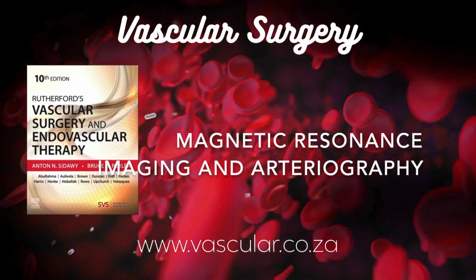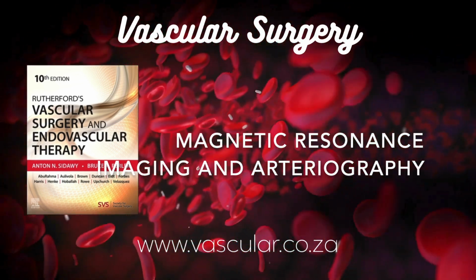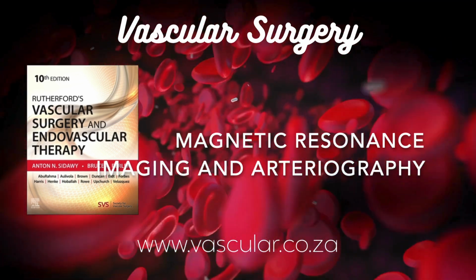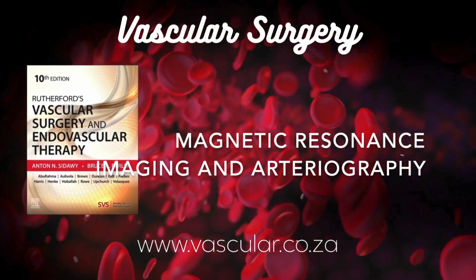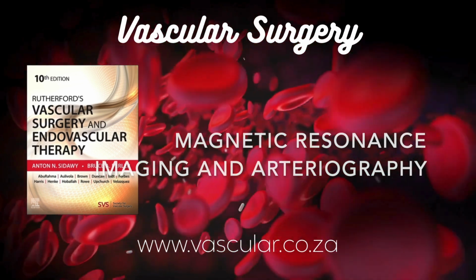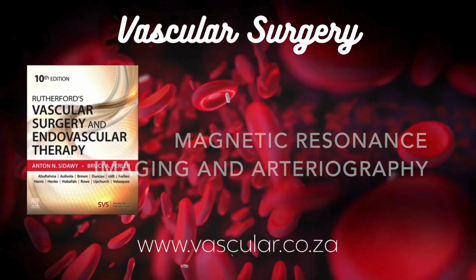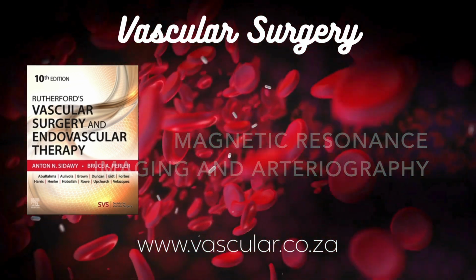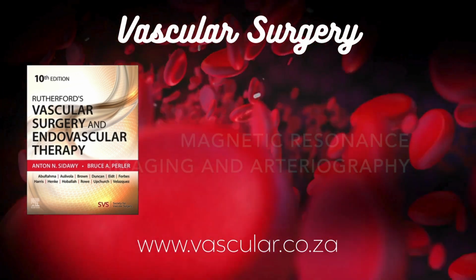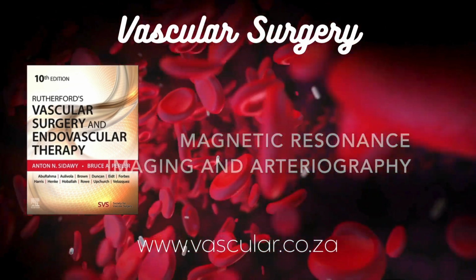Got it. What about those dedicated RF coils? Oh, absolutely crucial. Coils are the antennas that transmit and receive the RF signals. Using coils specifically designed to fit snugly around the body part you're imaging makes a huge difference in signal quality. It's like different shapes for different parts. Exactly. You'll have a neurovascular coil for the head and neck, maybe a long wraparound peripheral angiography coil for the legs, flexible phased array coils for the torso. Phased array?